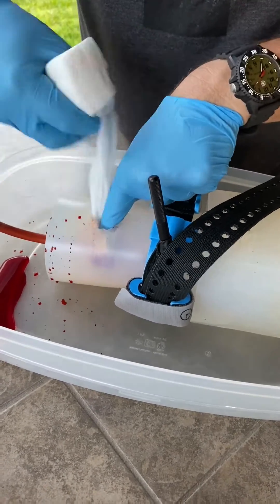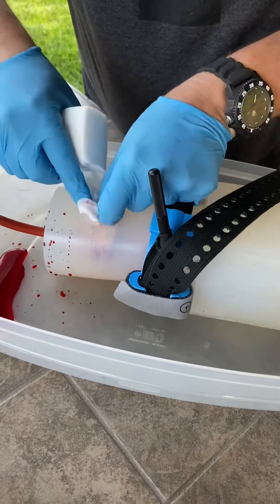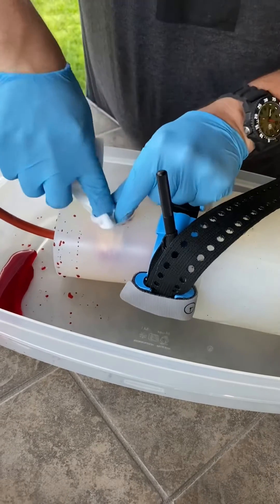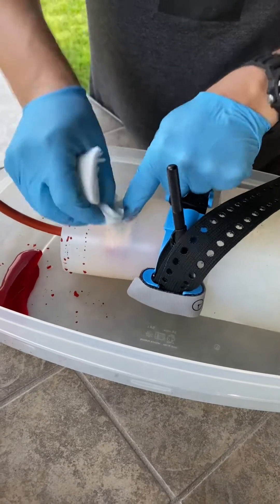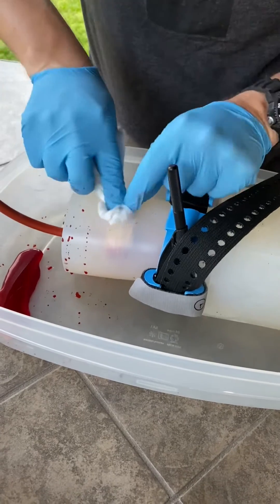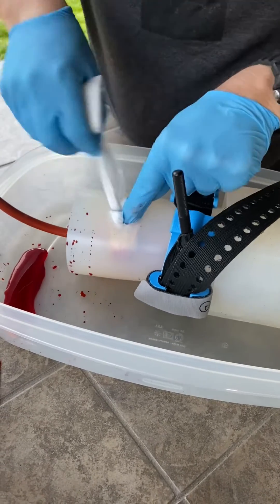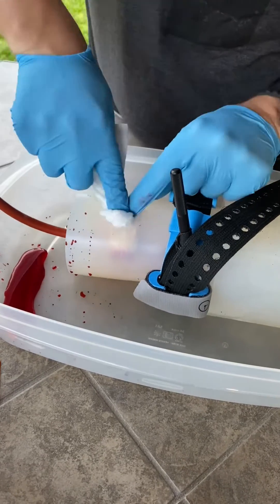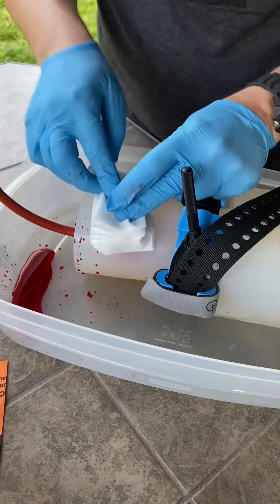As I'm packing the wound, it's critical to pack it in a systematic way where you're creating equal pressure throughout that cavity. As you can see, I'm going to every corner, going in the middle, all around, really trying to build a kind of cork inside this cavity. The pressure is the key here — pressure is king, you've heard that term.